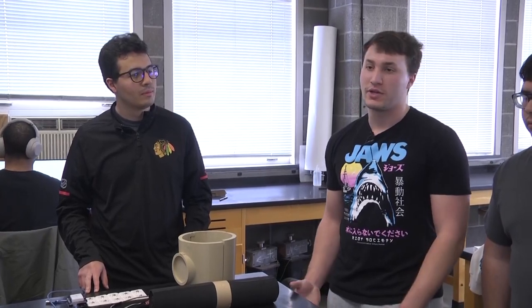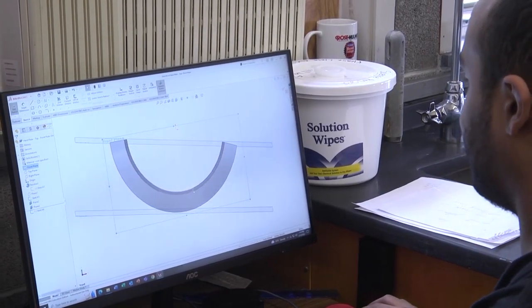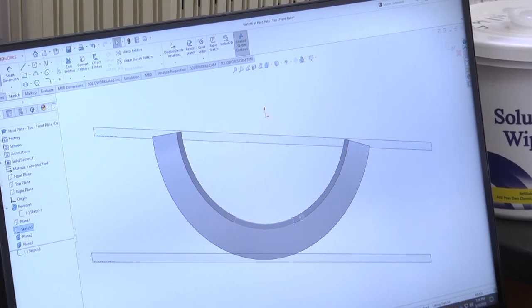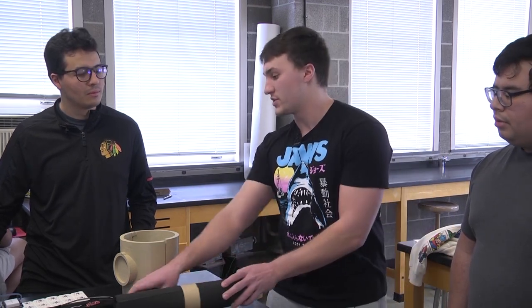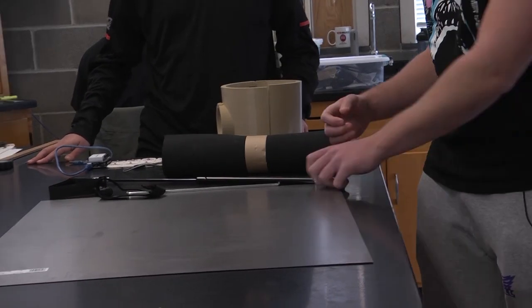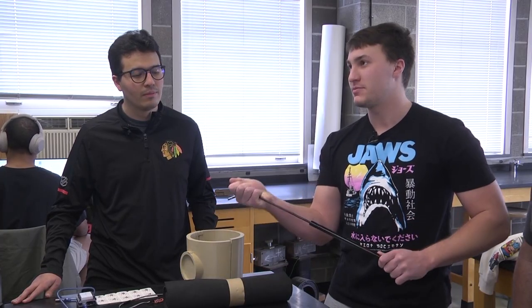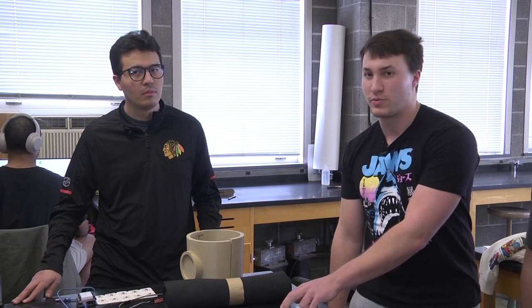We're mainly targeting people who are recovering from injury or people who are older and might have joint pain. What the brace does is essentially take some of the force that your knees, joints, and other parts of your leg would feel and disperse it through the brace. This pneumatic component here — not the final one we'll use — compresses like this, and when you're going down, all that weight goes down and this absorbs and compresses it.